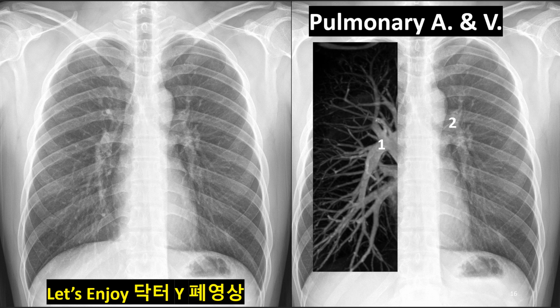Please focus on the right side film of the left side of the patient. This is a normal healthy young man's left lung on the right side film. Number 2 represents the left pulmonary artery. And now we see more clearly the left pulmonary artery and left pulmonary vein on this peripheral lung field of the normal chest radiograph.